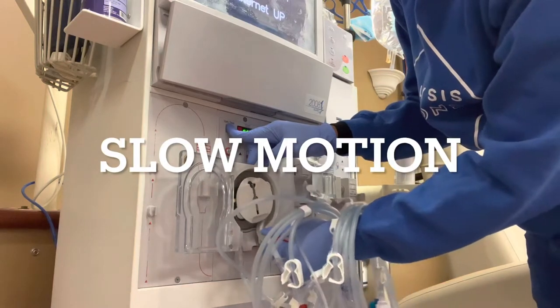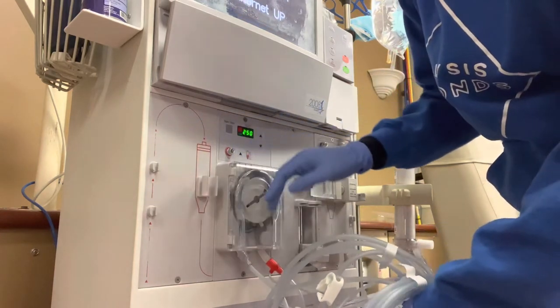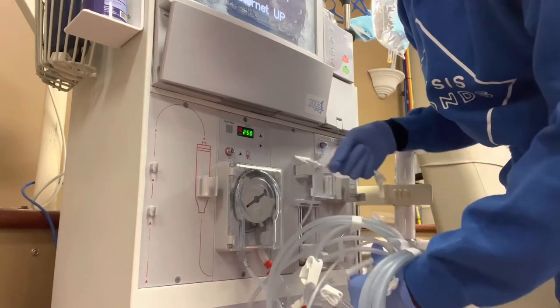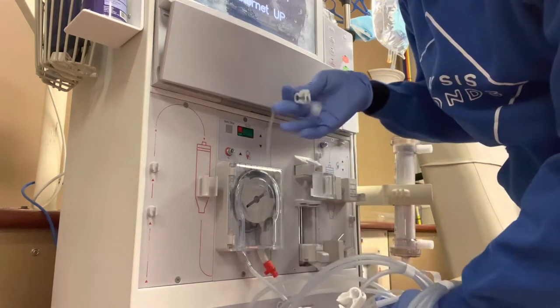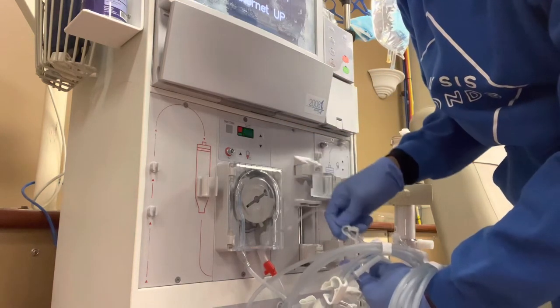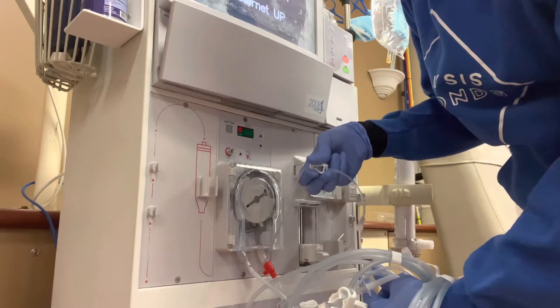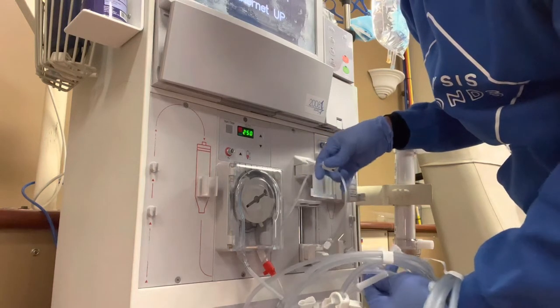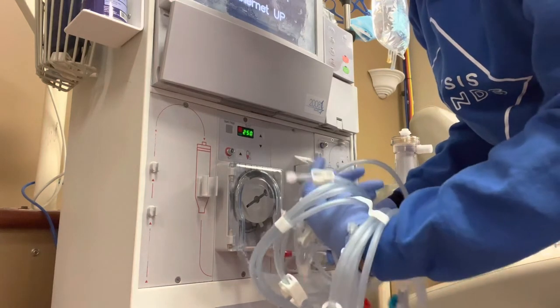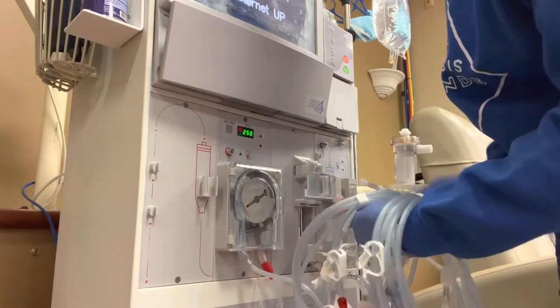So in this one, I slowed it down for those of us who need it a little bit slower, because I know me. It is important for me to clamp as I go. So that's why you'll see me do that. And I do that every time I set up a machine. I began doing that, I don't even remember when, but it's helped me thus far, especially during a rough, super fast changeover, like when you just don't have time.